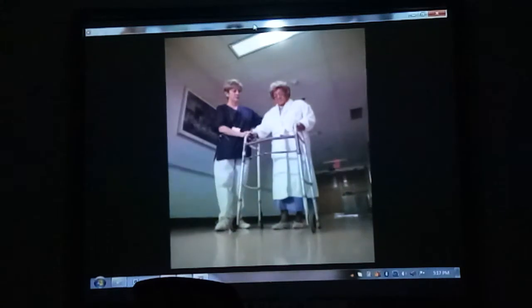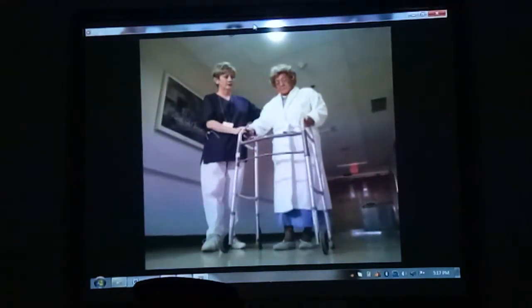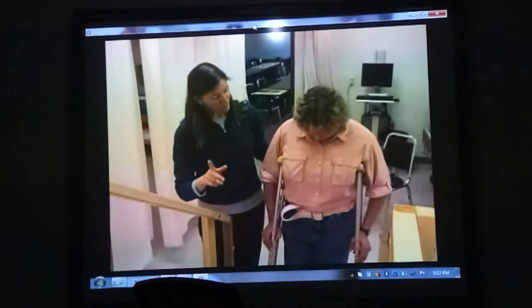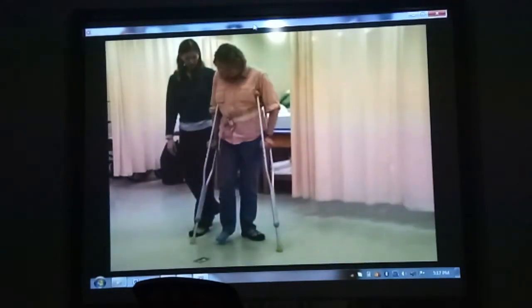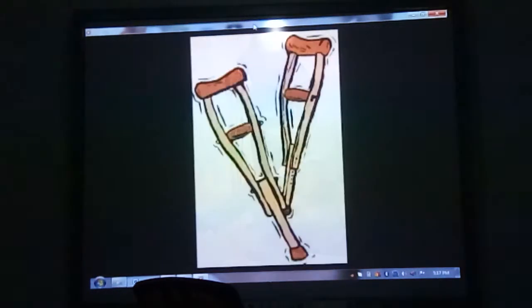When working with your patients on crutch gait training, it is important to understand the different weight-bearing terminology. Weight-bearing is the amount of weight that can be borne on an upper or a lower extremity during functional activities. The amount of weight-bearing permitted is dependent on the patient's pathology, impairment, and medical management. There are 5 commonly used terms to describe weight-bearing for the lower extremity that we need to keep in mind when we are doing gait training activities.